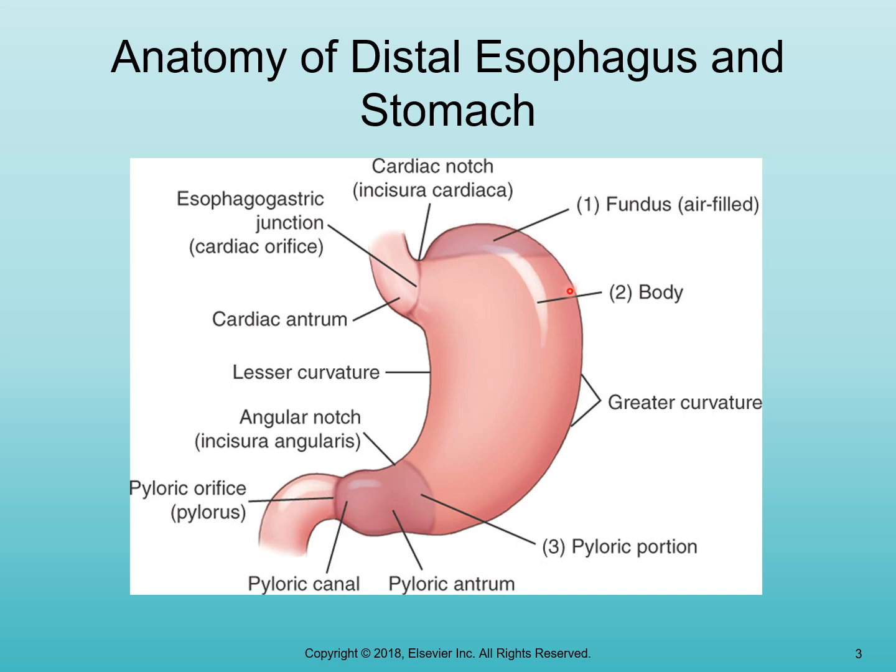You can see some of this labeling. You've got the greater curvature of the stomach, the lesser curvature, the angular notch, the pyloric antrum, the esophagogastric junction. Just more anatomy that is important when we're looking at anything with the images that we take, but specifically we will look at the air and the barium distribution within the stomach when the patient turns in different positions.